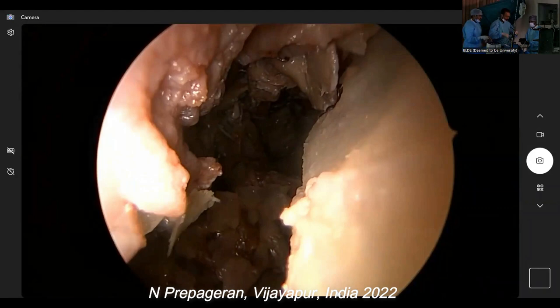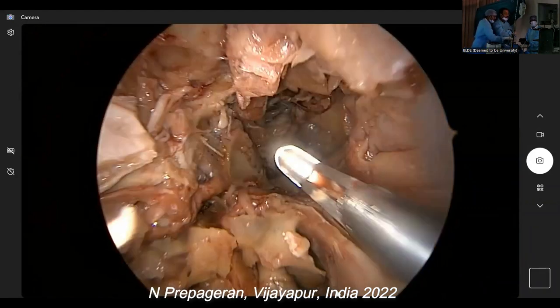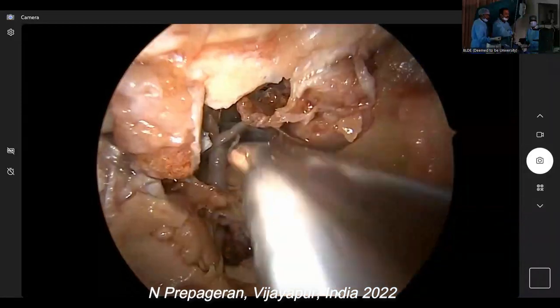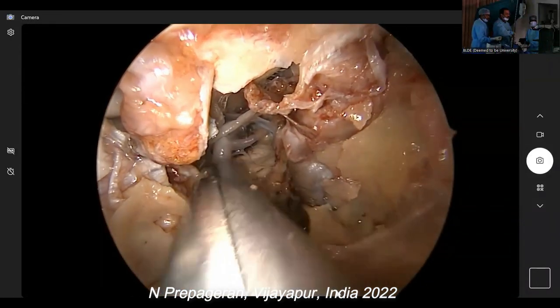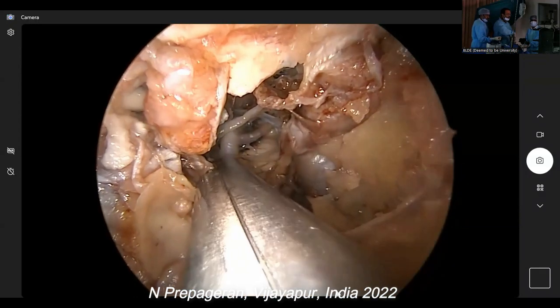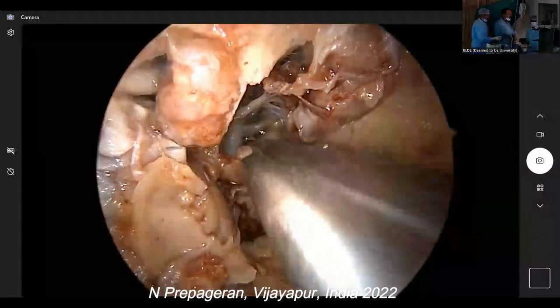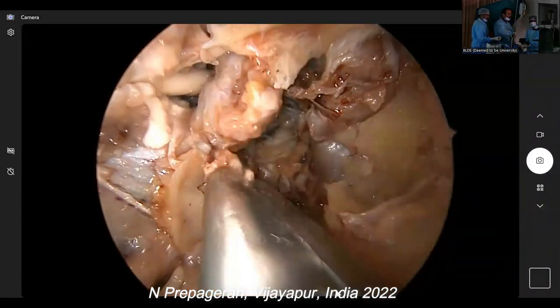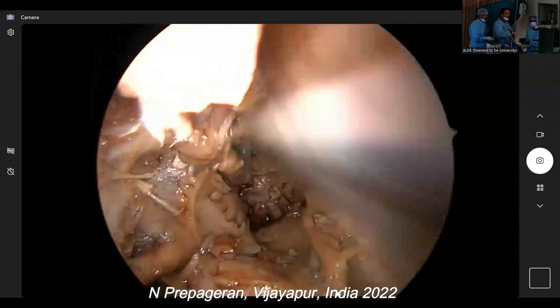So the problem we have is every time we introduce the scope, we hit the septum. The septum thing that they did before, the alar cartilage and all that, no? So that's why we have to maneuver our way in whenever we go in, so that we don't get it smudged.